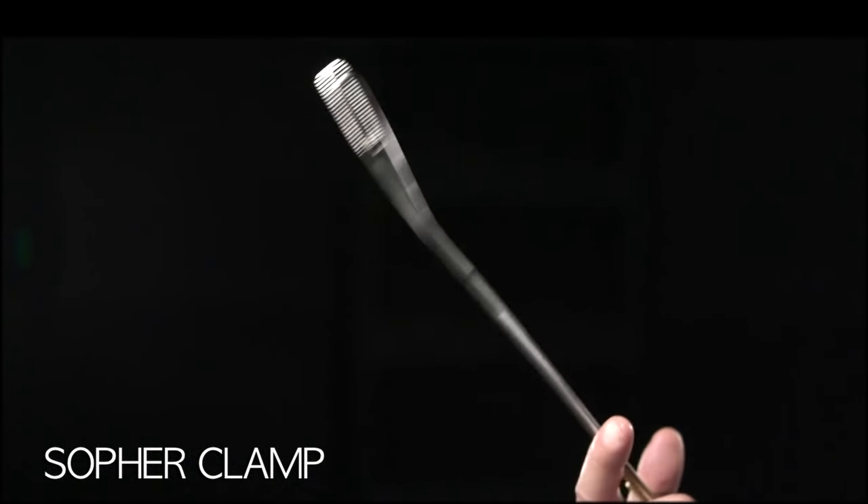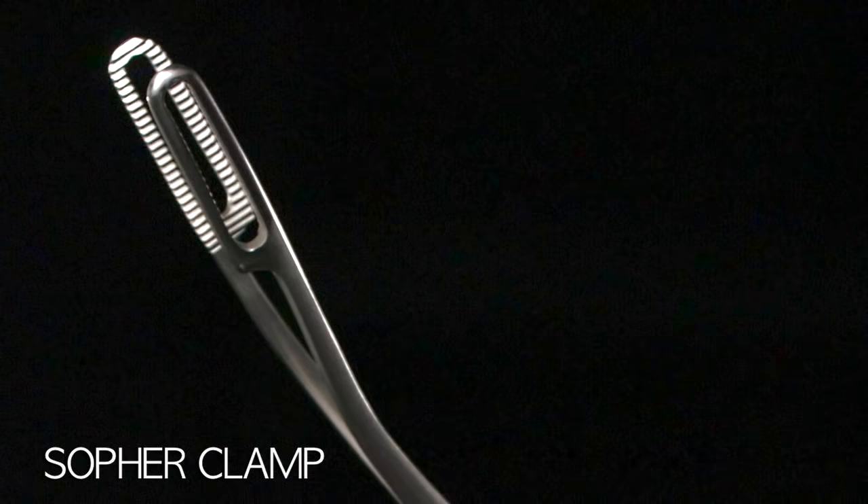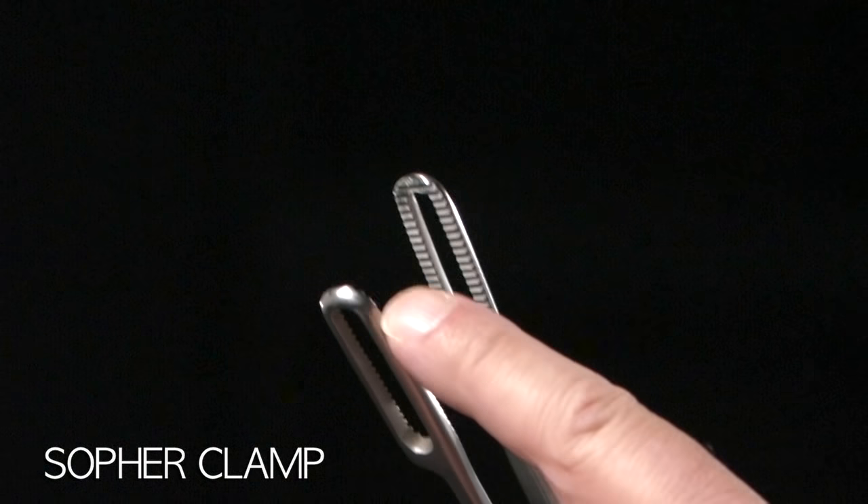This is a sopher clamp. A sopher clamp is made of stainless steel. It's about 13 inches long. The business end is about 2 and a half inches long and a half inch wide, and there are rows of sharp teeth. This is a grasping instrument. When it gets a hold of something, it does not let go.